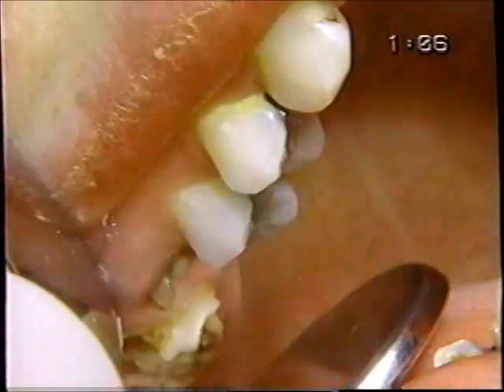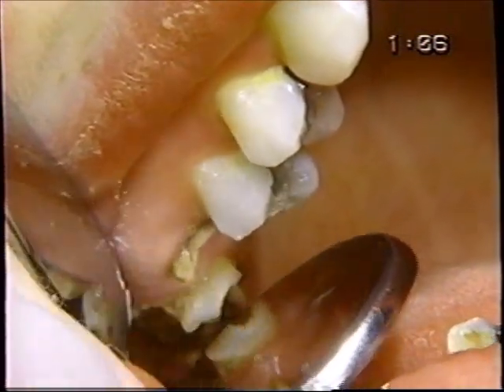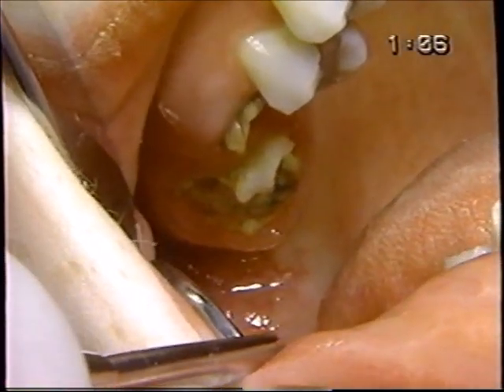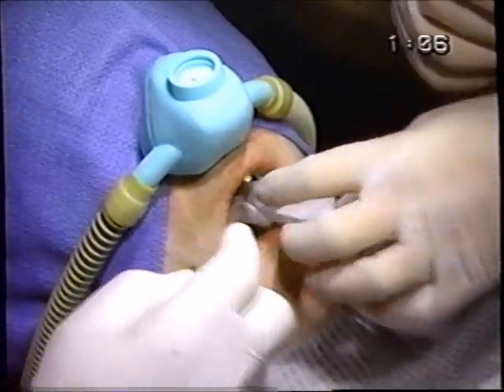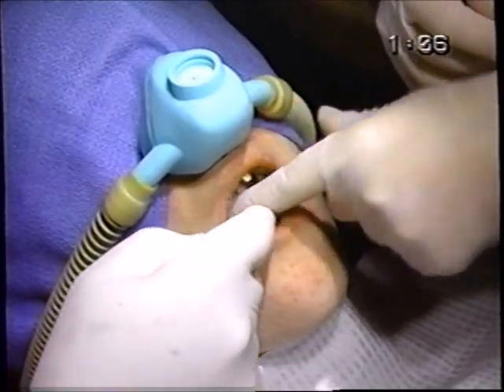We see again a couple molars here that have gross caries down into the root, and on the lower it looks like a third molar and a second molar. We're going to just put this piece of gauze back there, so you're going to feel it along the roof of your mouth a little bit, okay? So if a tooth kind of falls back, it won't go down your throat.